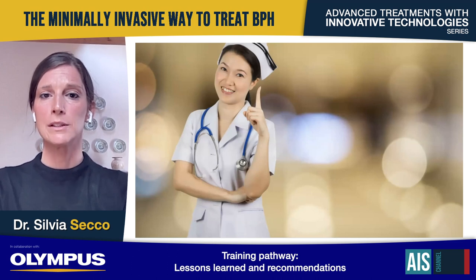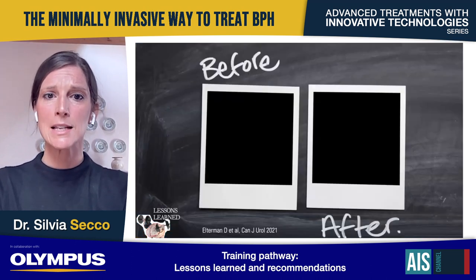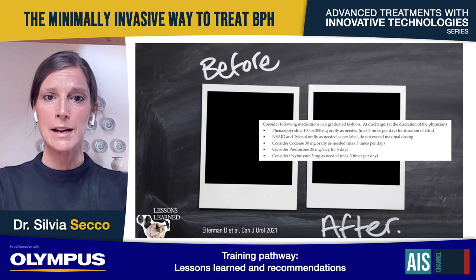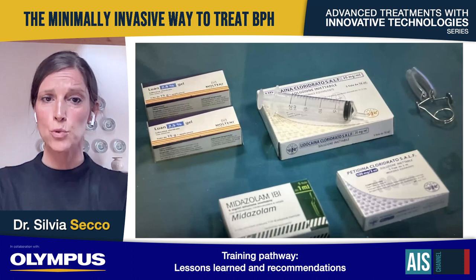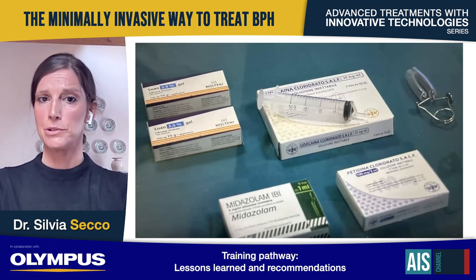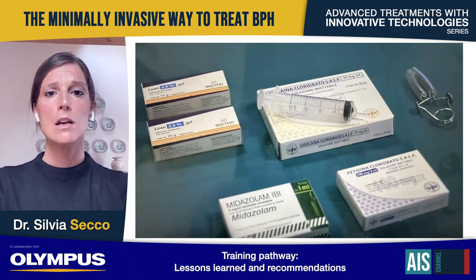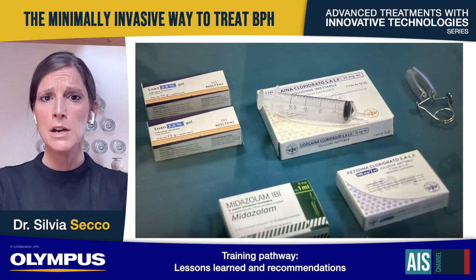But it's also important to remember that there are medications that have to be used before and after the procedure. In these slides, I present the protocol used by the Canadian colleagues, but different centers in different countries all over the world can have their own protocol. I personally perform the procedure only in local anesthesia, injecting cold lidocaine and cold lidocaine jelly 20 minutes before the procedure, clamping the penis with a penile clamp. And before inserting the cystoscope, both the rigid or the flexible one, I inject again cold lidocaine and cold lidocaine jelly. If I have the perception that the patient is anxious or if he complains of some discomfort, or even if he asks me, I premedicate him with benzodiazepam and narcotics.